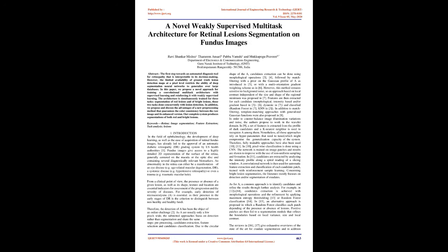Introduction. In the field of ophthalmology, the development of deep learning, as well as the ease of acquisition of retinal fundus images, has already led to the approval of an automatic diabetic retinopathy (DR) grading system by U.S. health authorities. 1. Fundus images give access to a highly detailed 2D representation of the surface of the retina, generally centered on the macula or the optic disc and containing several diagnostically relevant biomarkers.